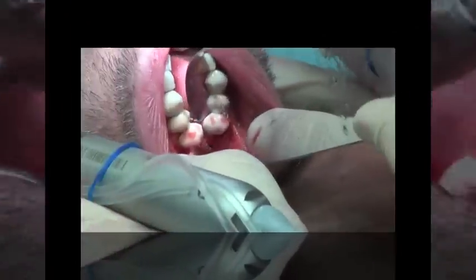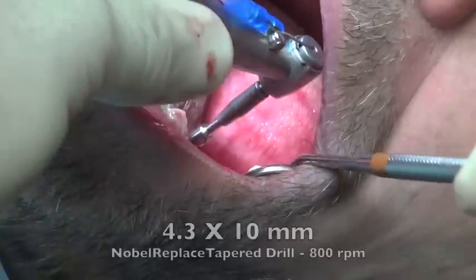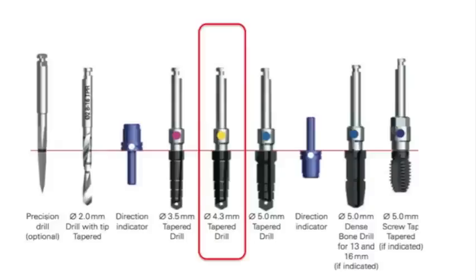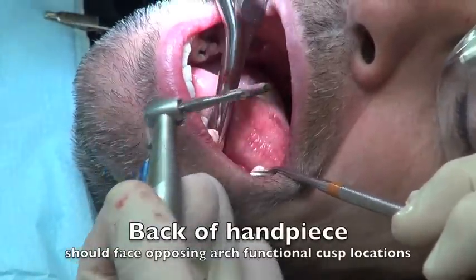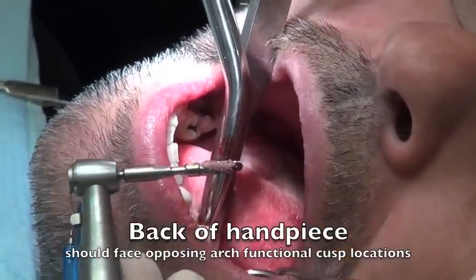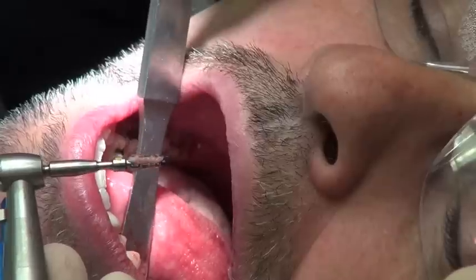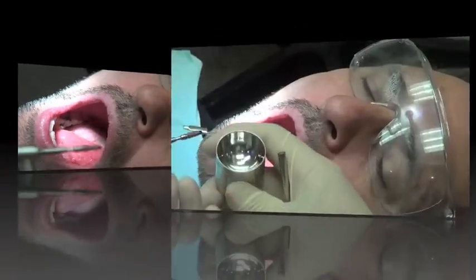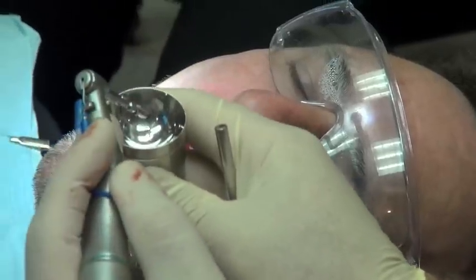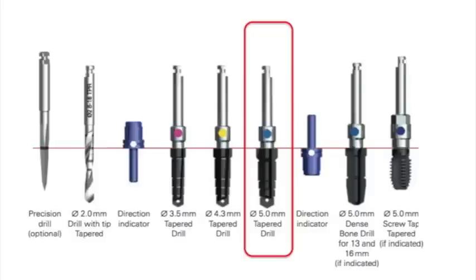We want to make sure we're in the same angulation. It's always good to look at the osteotomy and make sure you're on course — angulation, depth. We then take the 4.3 by 10mm tapered drill and penetrate the same osteotomy site to make it wider, at the same depth and the same angulation. I want this drill pointing at the top lingual cusp, which is the functional cusp of the top tooth. Look at the bone we're collecting here — it's prudent to keep this bone in case we need to put it into another area like that back defect. We then go to the 5mm by 10mm long tapered drill.